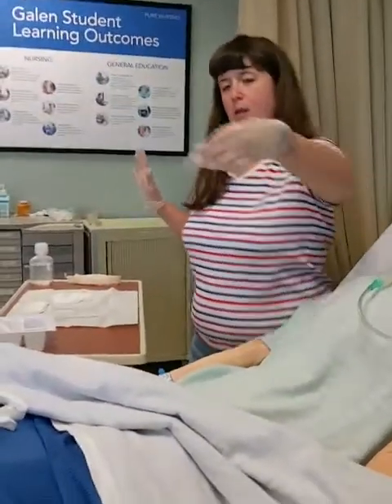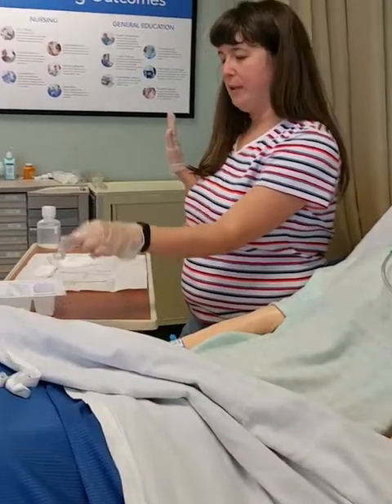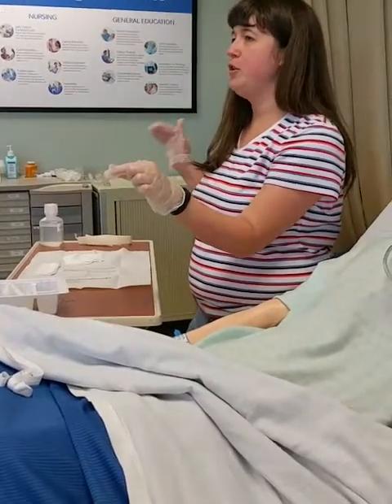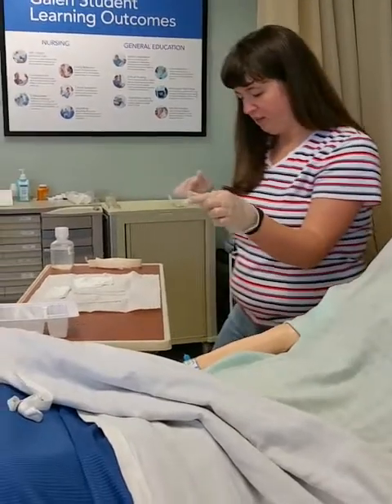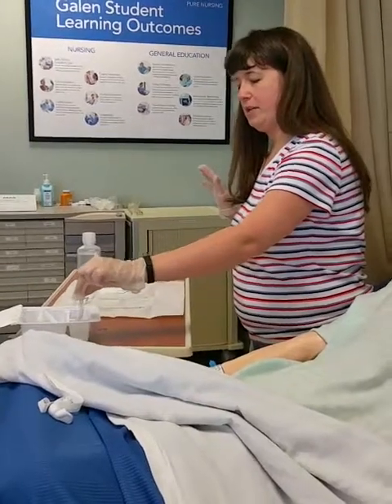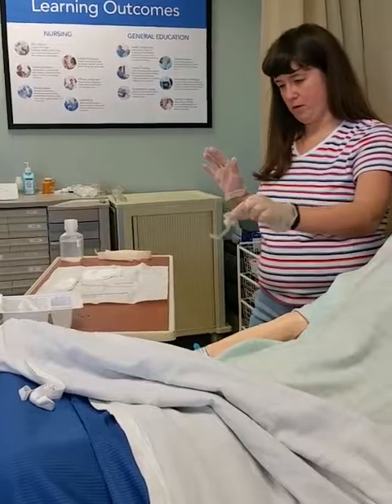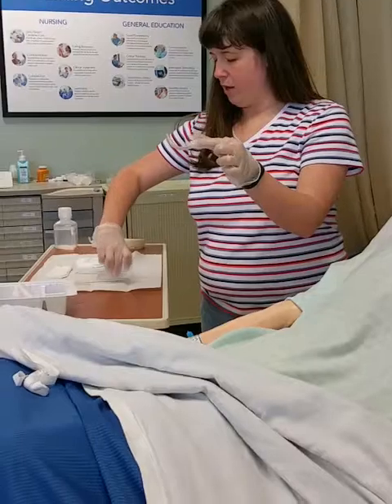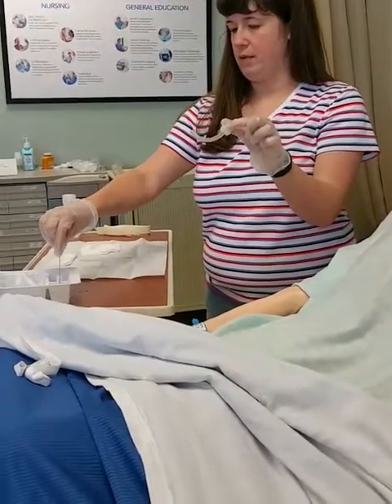Okay. Now, depending on how nasty this is, you can dip it or you can soak it. Most of the time, if you did a good suction, you should be able to kind of dip it. But if not, or you have that patient that's just full of secretions, so I'm going to dip it in. I'm going to rock it back and forth. Okay. Then I'm going to take my brush. I'm going to dip it just because it makes it easier.